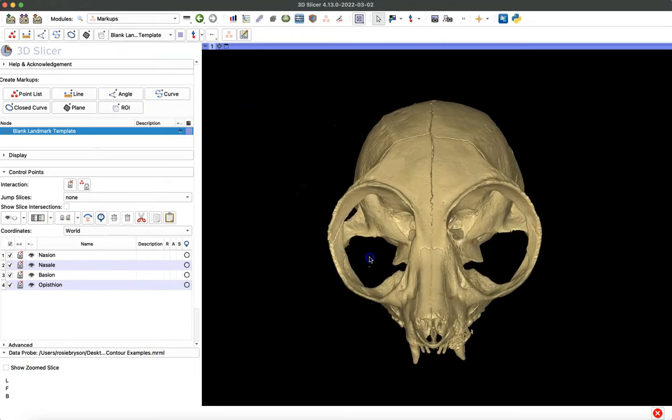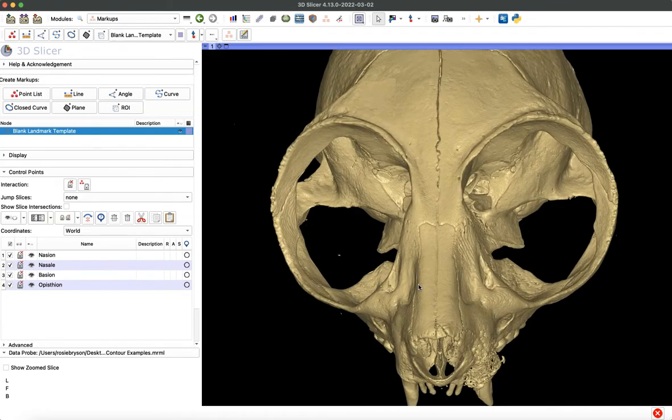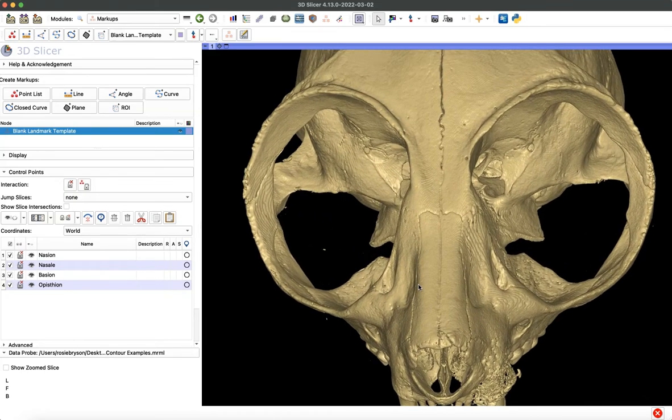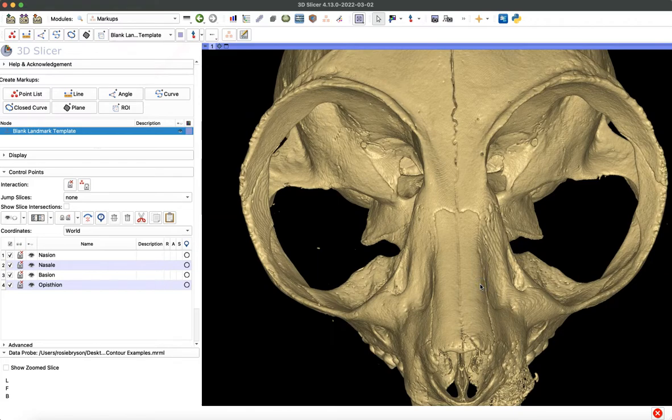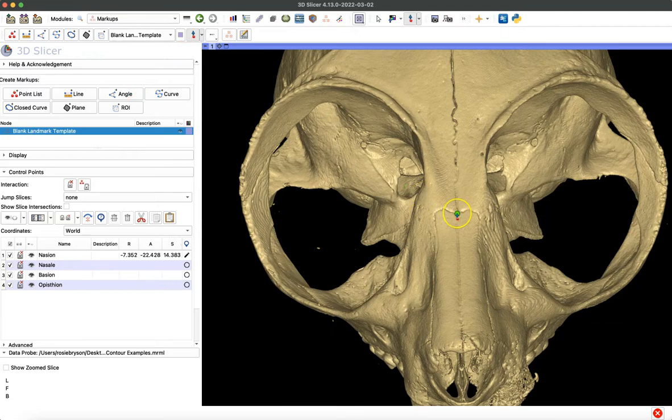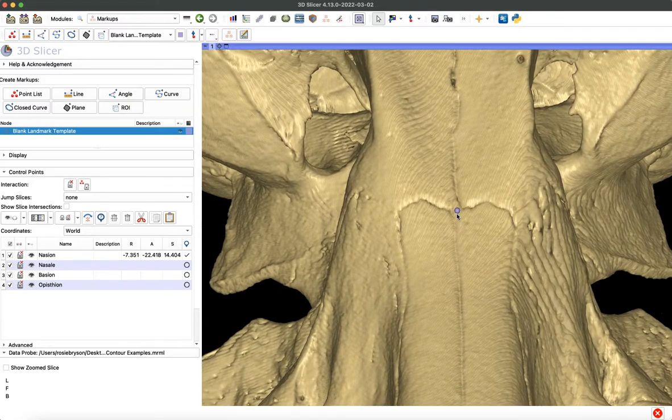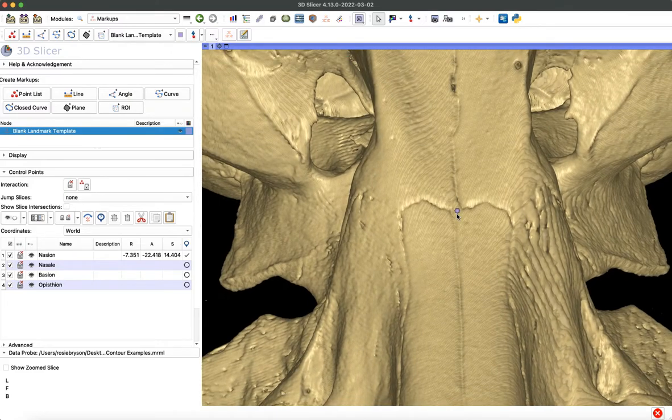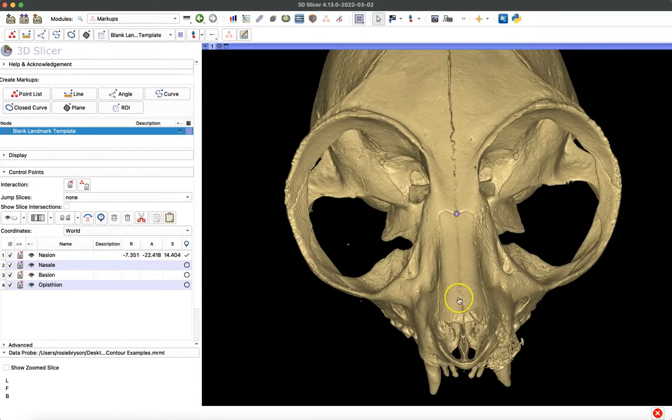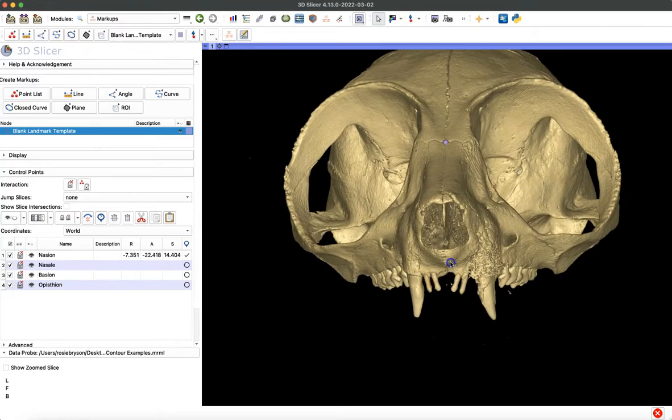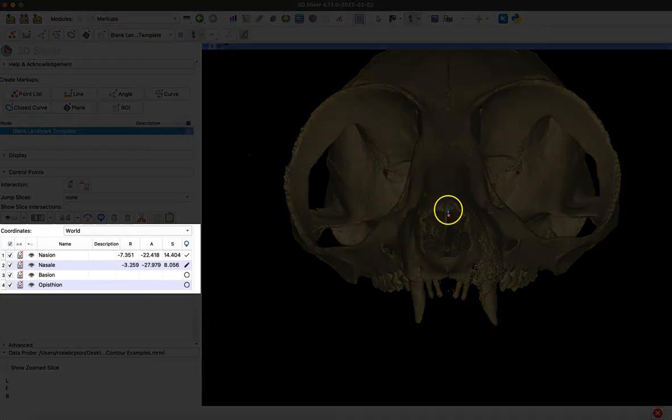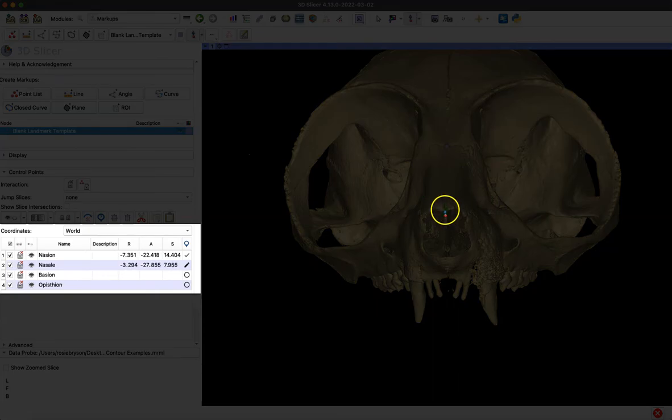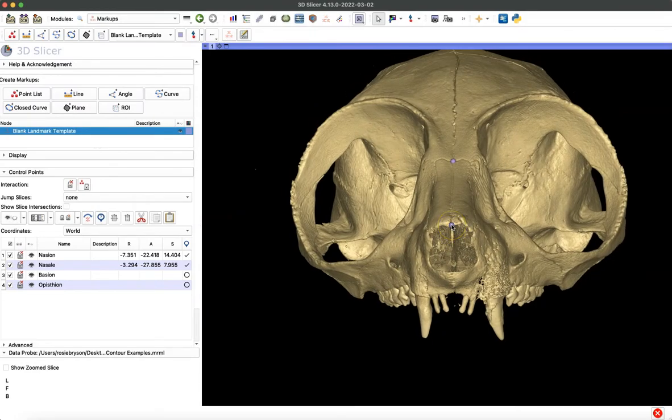When you're placing landmarks, you really want to zoom in so you can place them as accurately as possible. Today, I'll just be moving pretty quick. When you're ready to place your first point, you click this icon to the left. You can see it glows green until you place it, and then it turns purple. You can customize those colors as well. When I'm ready to place nasale, I'll select that icon again. You can see those coordinates changing for nasale until I place that point, and then they're stable. You can see a checkmark next to both of those.